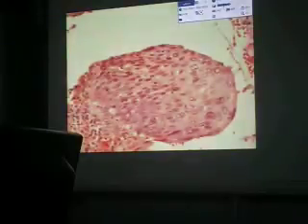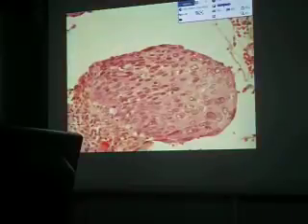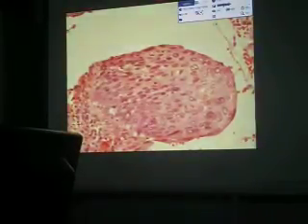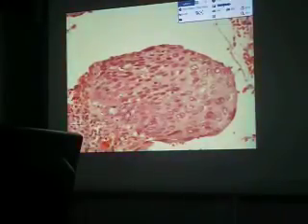Okay, so there is full thickness atypia, so that the cells at the superficial layer are already displaying large nuclei, and that cell is about to undergo mitosis, indicating that those cells are multiplying at a very fast rate, because normally mitotic activity is limited only at the basal layer. As the cells ascend to the superficial layer, they will lose that capability to multiply. Okay, that is why it is called stratum germinativum. Germination layer is the other name of the stratum basale.